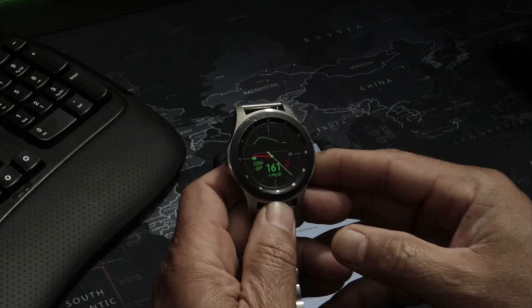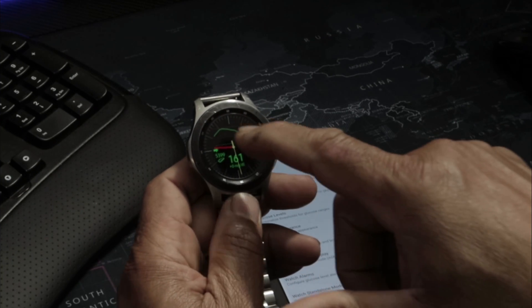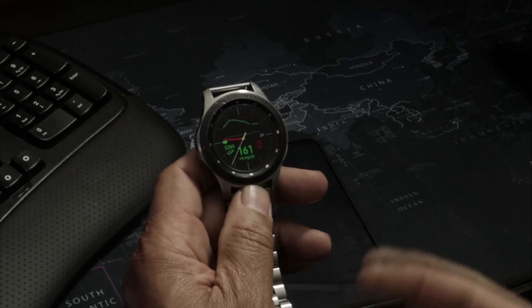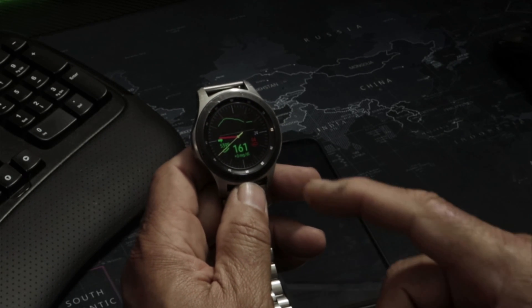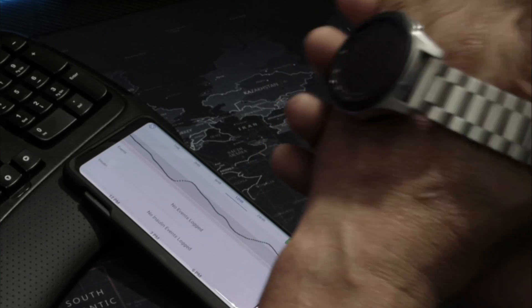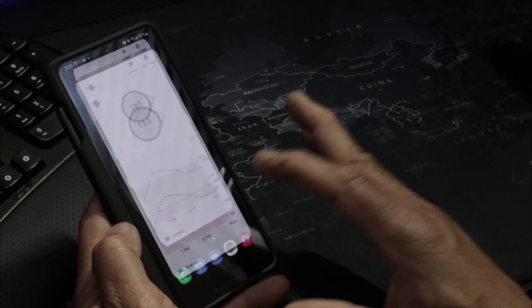I have everything set up how I want it — a trend line showing when my sugar is going up or down. Right now it's going down, and my current reading is 161. I just had dinner, so that's why it went up. I really like this — it makes a big difference in controlling your sugar, having it right there on your wrist so you're not watching your phone all the time.